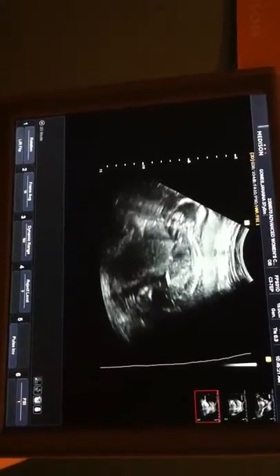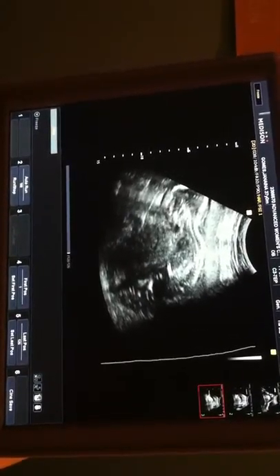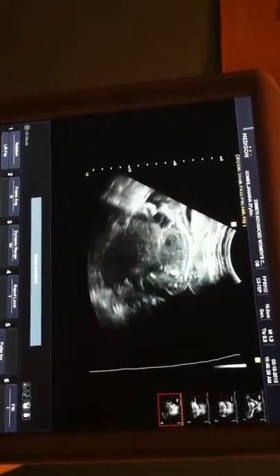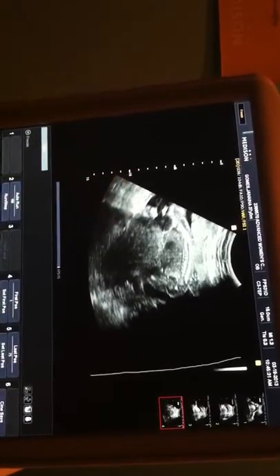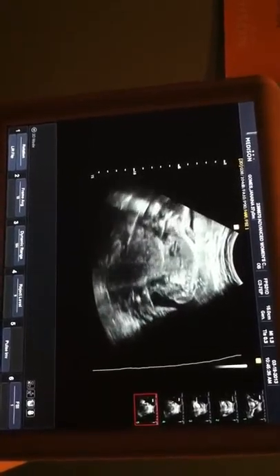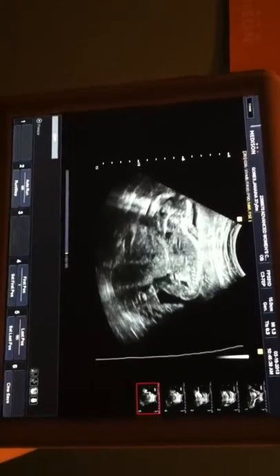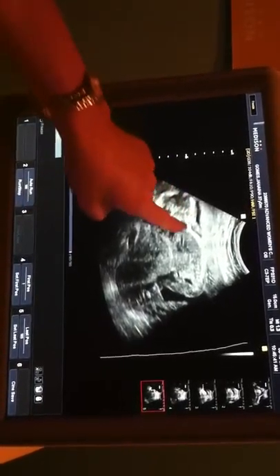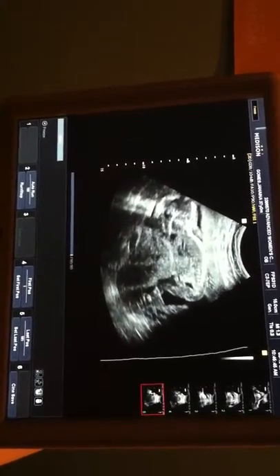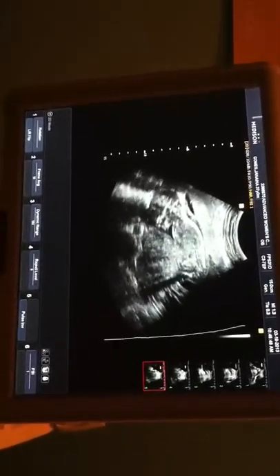Look at his tummy, there's his little spine. Come on, Samuel. Spine all the way down to the tailbone. Head, spine, little hiney sticking over there, down to the knee, and then kind of lose the lower leg there. He just snuggled down, happy where he is at the moment.